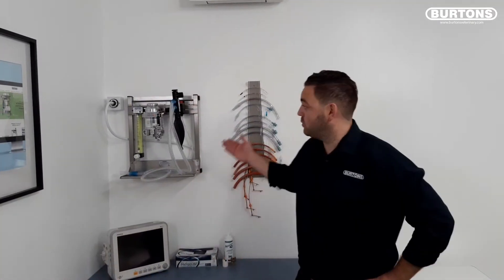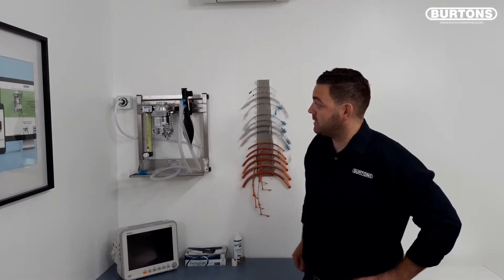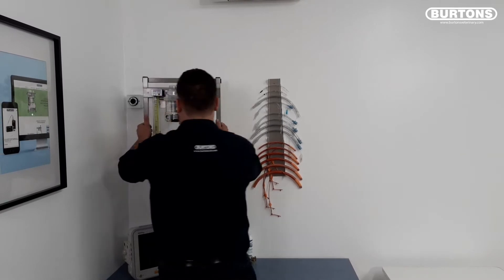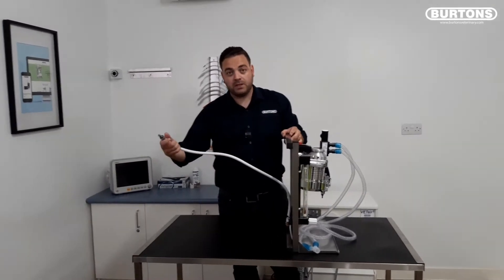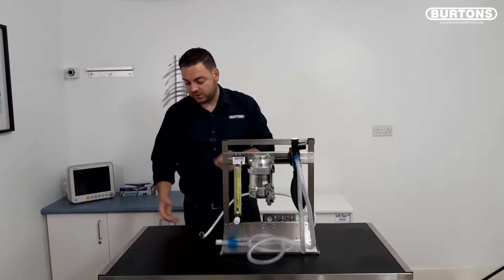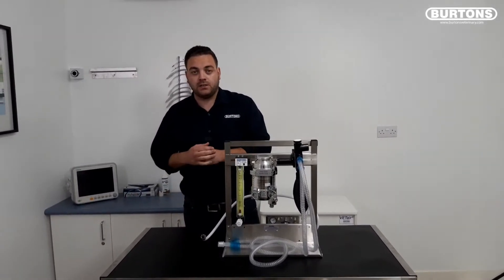Firstly, the Burtons wall mounted anaesthetic machine. As you can see, this machine is ideal for practices with pipe gas. The machine itself comes equipped with a one metre pipeline lead with Schrader, that can be attached to smaller E or F size bottles if you're not running a pipe gas system with the appropriate regulator and cylinder cradle.